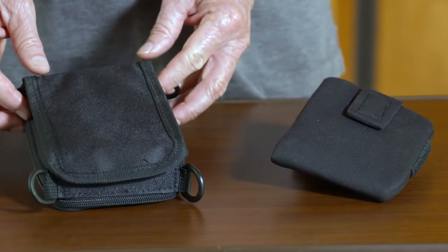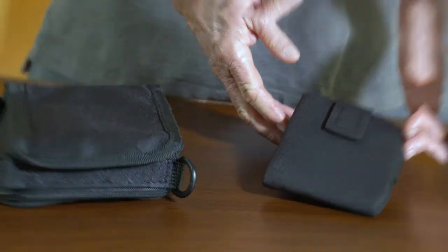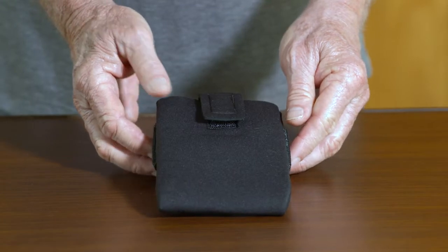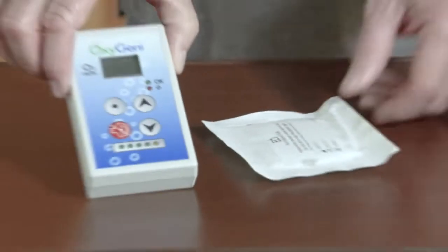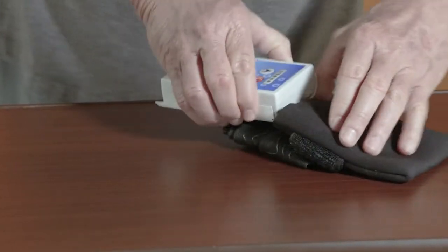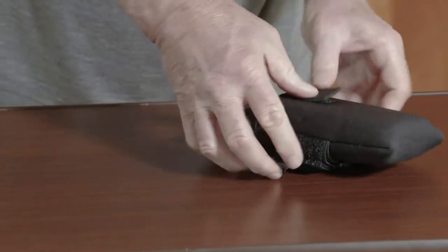The two cases are the universal carrying case and the arm leg strap carrying case. Let's take a look at the arm leg carrying case. Unfasten the small velcro strap at the top of the case, then slide the Oxygeni and Humidikant pack into the case and fasten the velcro strap over top of the Oxygeni.